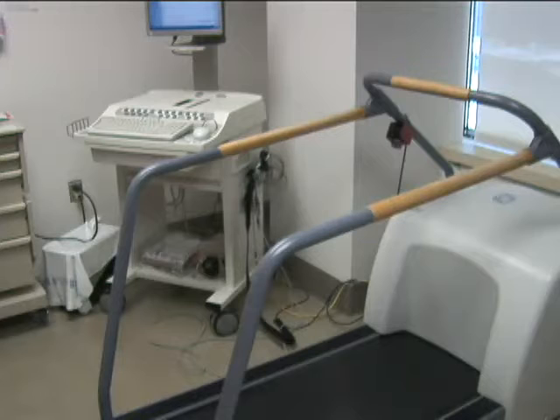Ensure that the equipment and supplies needed for treadmill exercise echocardiography testing are present. This includes the treadmill, ECG monitoring machine, ECG acquisition module, blood pressure monitor, resuscitation capability, such as a crash cart, and the ultrasound machine. A qualified medical professional, such as a physician, nurse, or exercise technologist, is present throughout the study to monitor the patient. A cardiac sonographer is present to record the echocardiographic images.